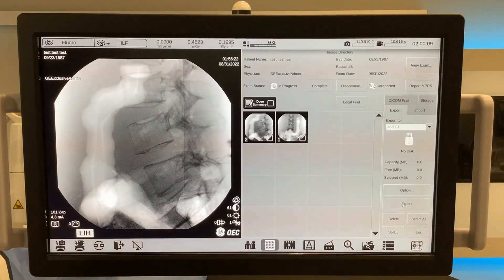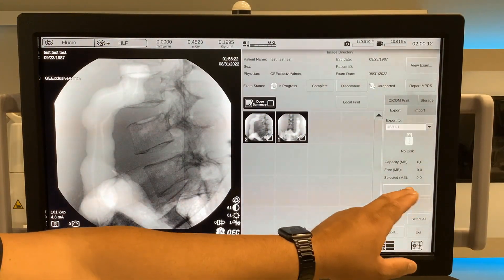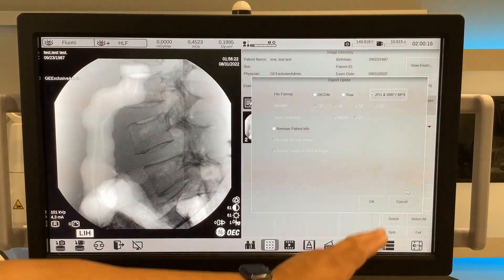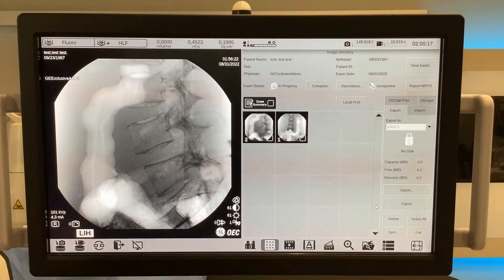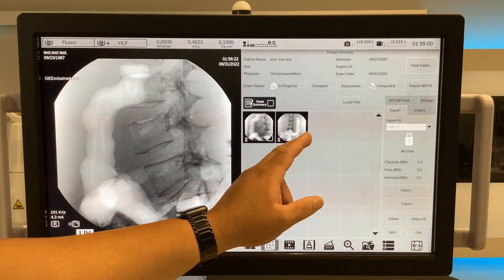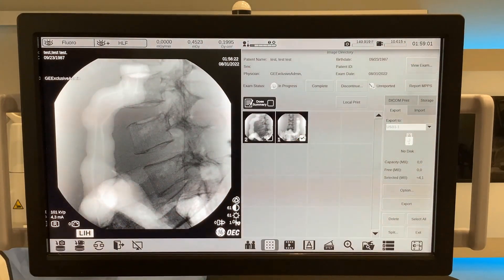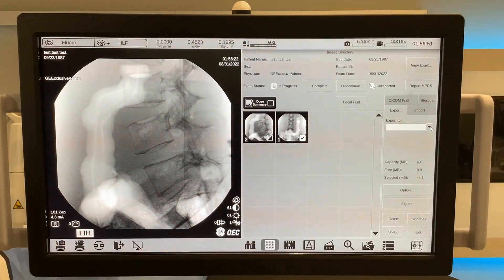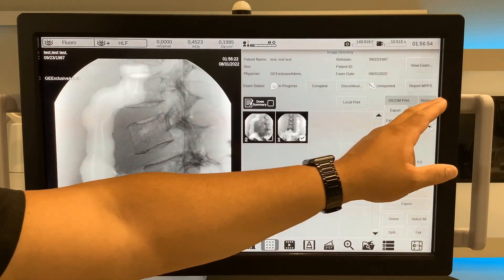To send images to a USB, plug in the USB. Select the option to decide which file types should be sent. Select OK when configured. Select desired images. Select export to send.